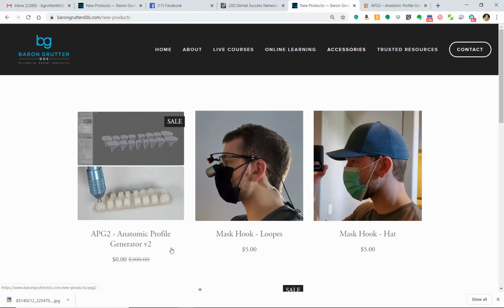Notice I said buy it. It is $0. We used to sell the software before, a different version of this, for $300. We have recreated the software completely, and we are giving it away. We really just want to bring back the idea of creating better emergence, but we don't want people to be strapped to do it. We want you guys to be able to just have this, download it, and have fun with it.